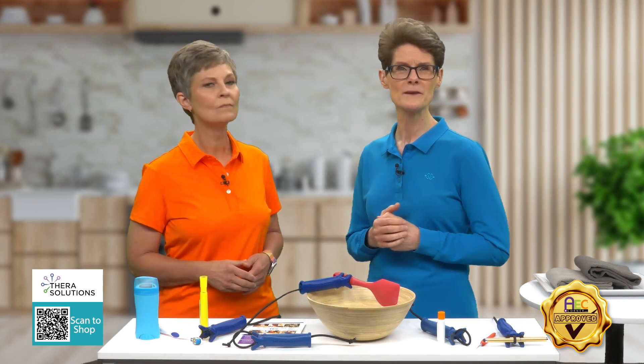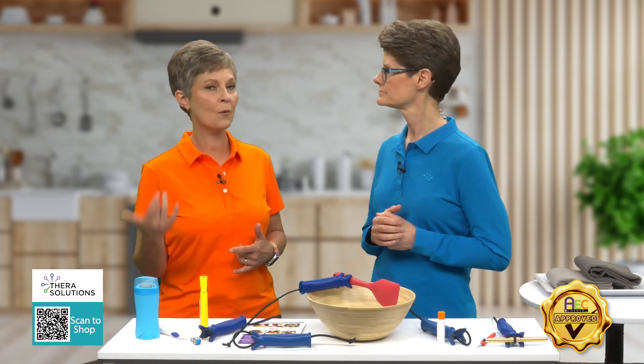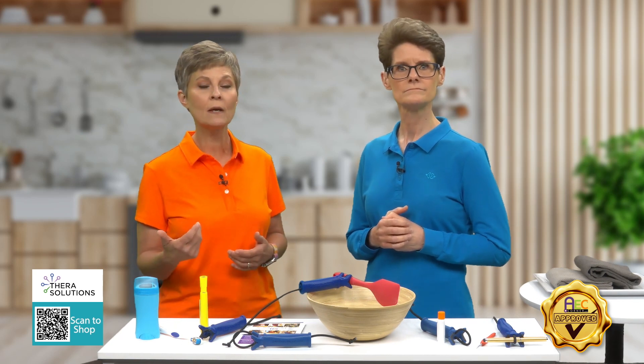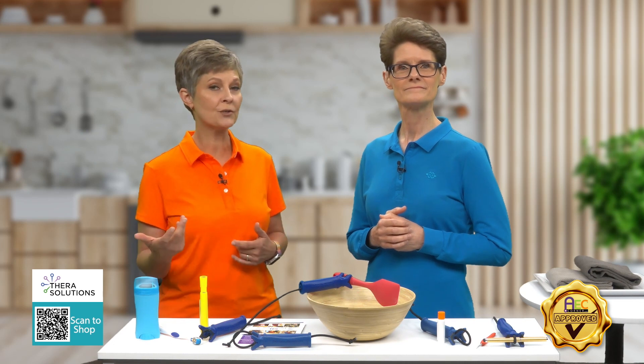So, who might benefit from using the Functional Hand? Pretty much anyone with challenges like grasp difficulties, arthritis, cerebral palsy, maybe post-stroke, or Parkinson's, and just generalized weakness, just to name a few.